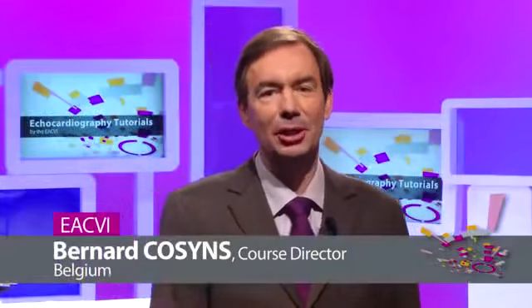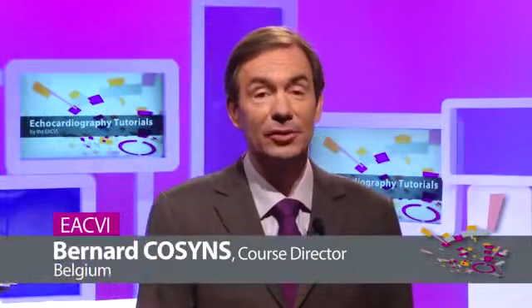Dr. Erebots will now show us how to set up the echo machine. Of course, it's very important to optimize the image, because the analysis and the interpretation of the echo image is highly dependent on the quality of the acquisition. Therefore, he will show us how to optimize the images via different parameters and also how to prepare the patient.